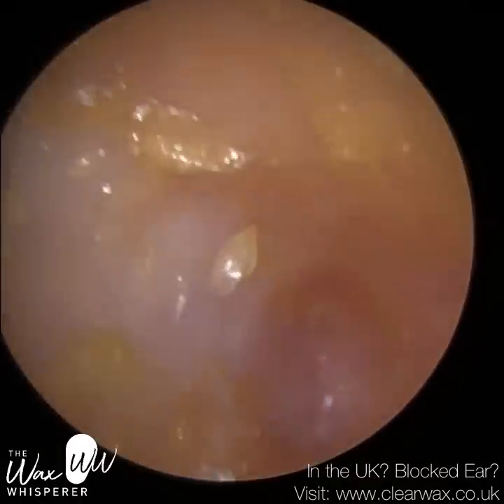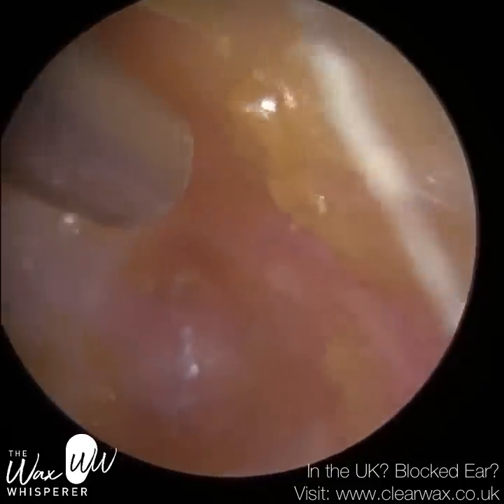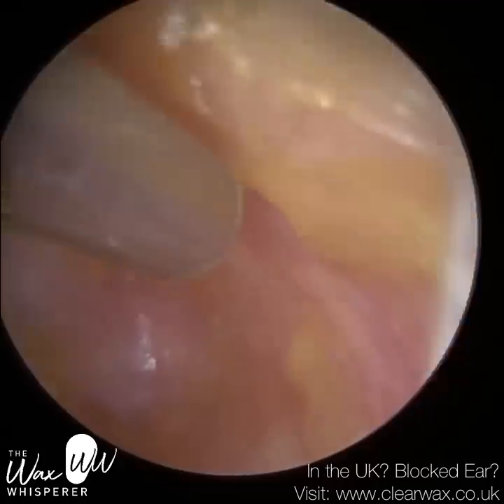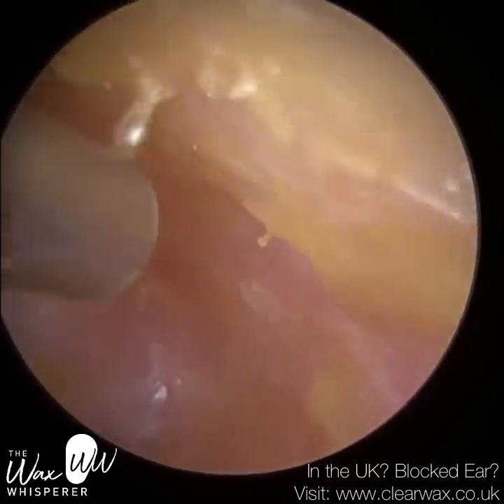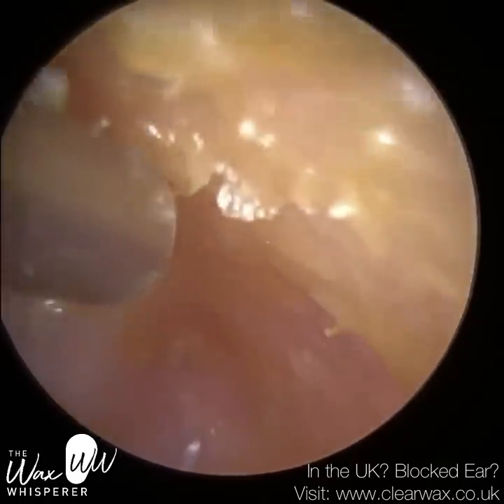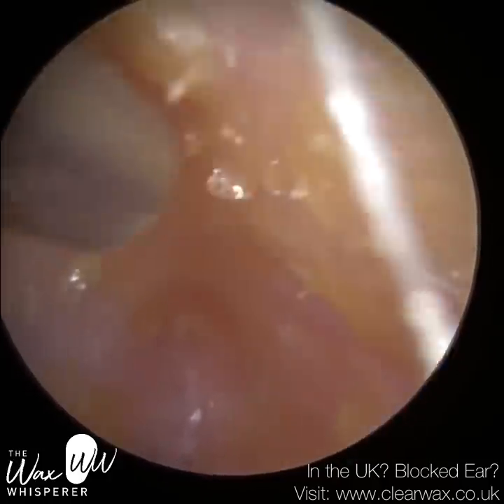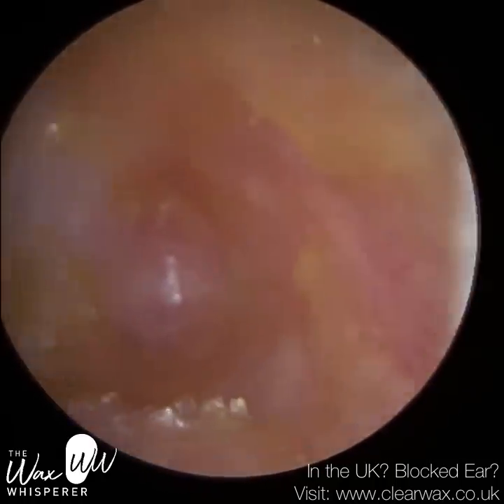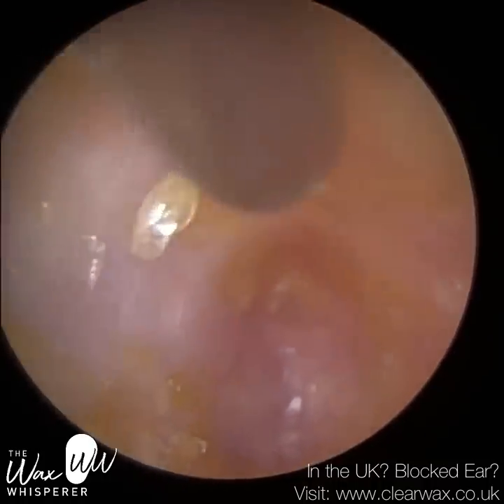We have to accept that no matter how much you clean this ear, this condition is chronic unless they have revision surgery to try and remove this fibrous tissue. So we've got to be sensible. We don't want to overdo it where we're going to cause trauma to this, because by causing trauma to the false fundus, we may encourage more growth of this fibrous tissue and make their false fundus even worse, which is the last thing we want to do. So I'm just hovering around the edge. So it's just a bit of dead skin superiorly here.